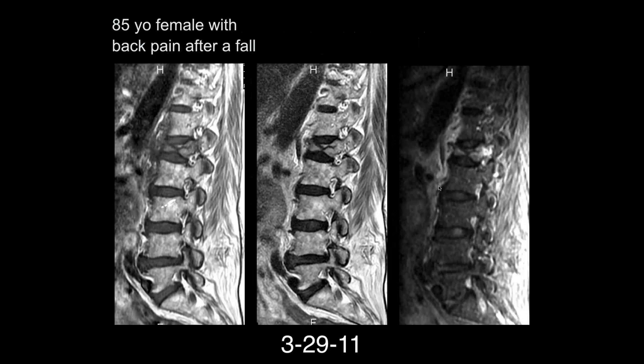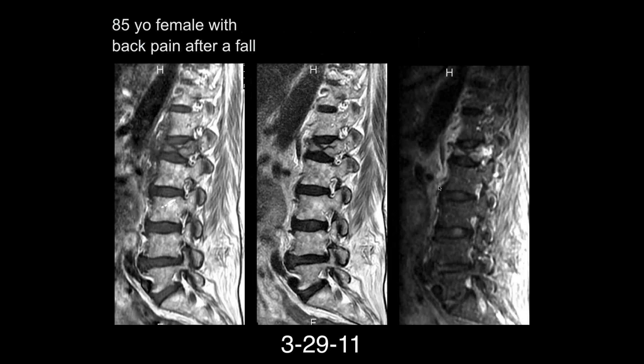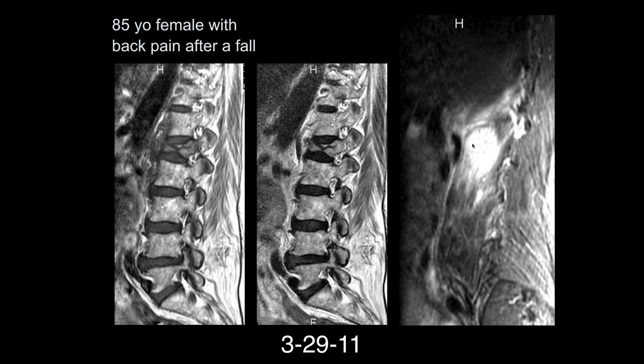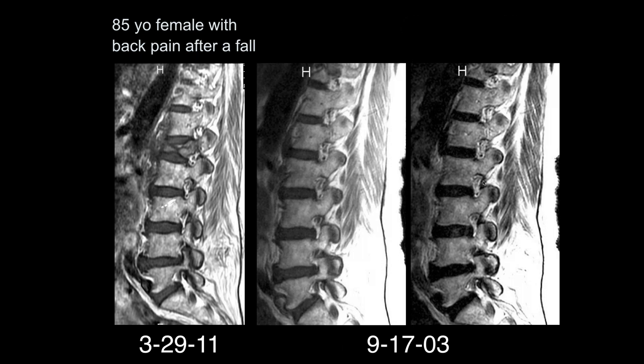Severe compression deformity of L1 with a horizontal chance-type component. On a more lateral sagittal image we can see a hematoma. This was also a follow-up study — actually, this was a previous study before the fracture, and you can see the change in morphology due to the fracture. That was an acute compression fracture with a lateral hematoma just as suggested.